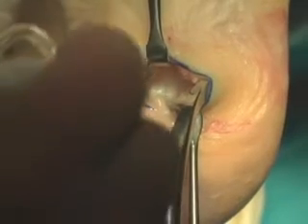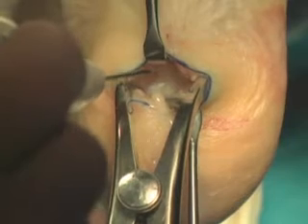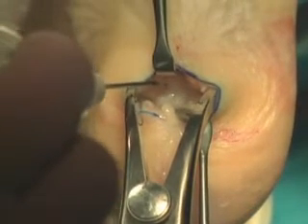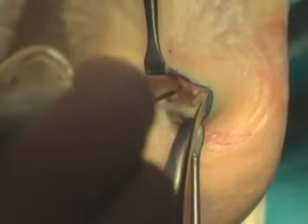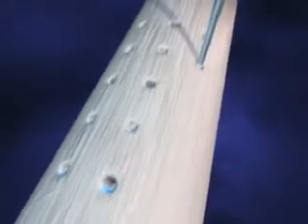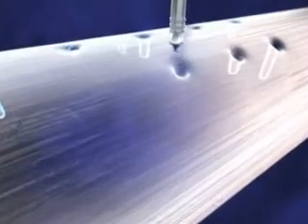Place the tip of the device on the surface of the fascia perpendicular to the structure. Activate for 1/2 second with light pressure at 3 to 5 millimeter distance intervals on and around the fascia. Alternate perforations from superficial to 3 millimeter to 5 millimeter depth, creating a 3-dimensional grid-like pattern.